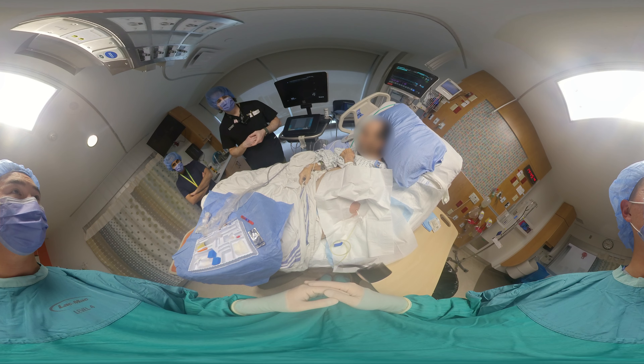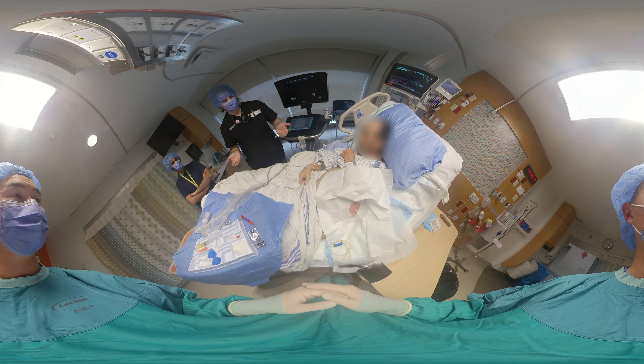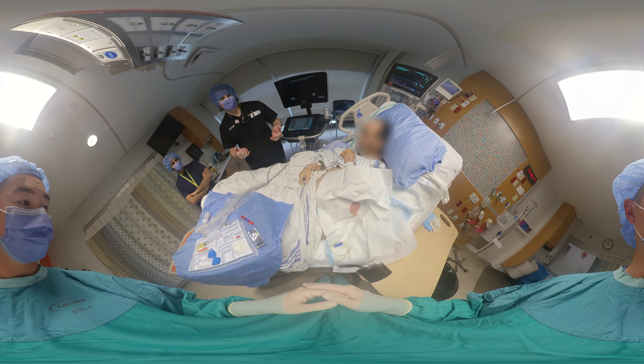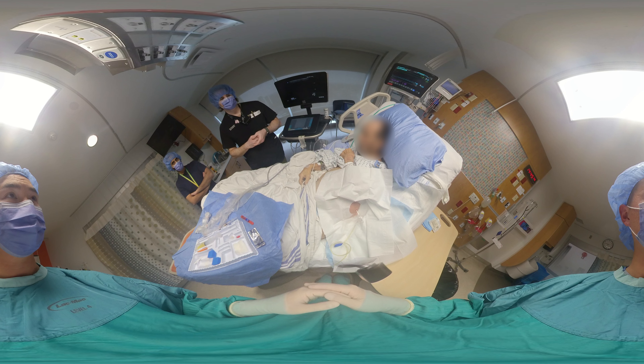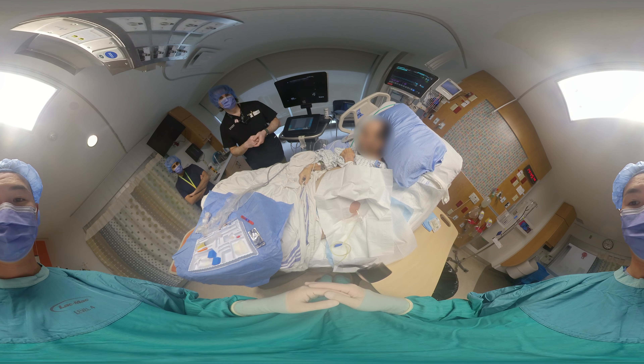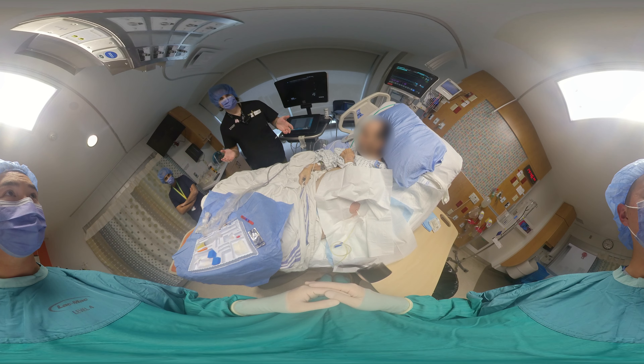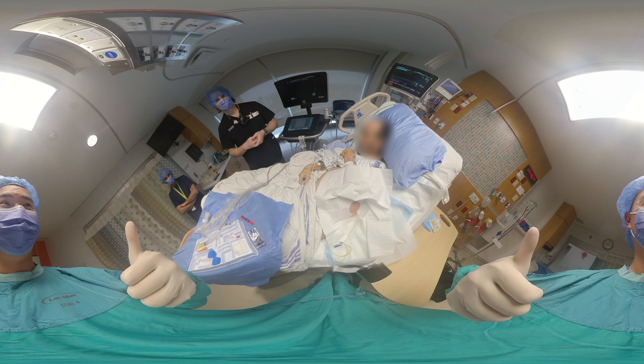That's the conclusion for the procedure — it's fairly straightforward. After you're satisfied with the drainage, clamp the drainage, remove the catheter, and place an occlusive bandage over the site. Then ask the patient to roll over onto the contralateral side just to prevent an ongoing leak of ascitic fluid.